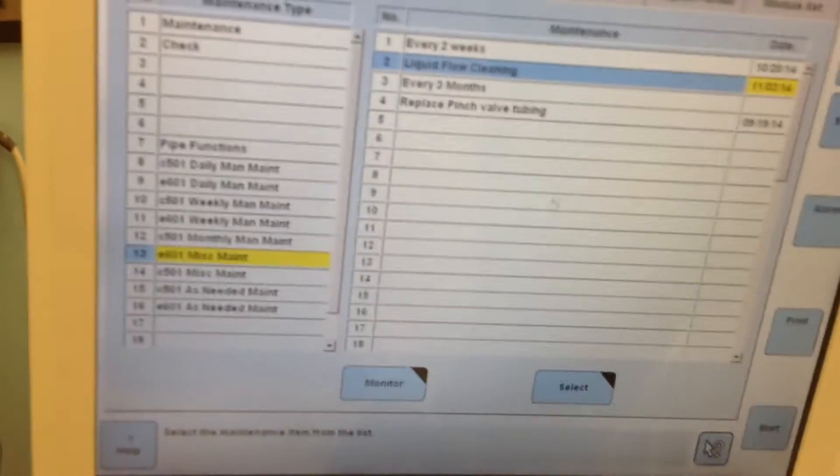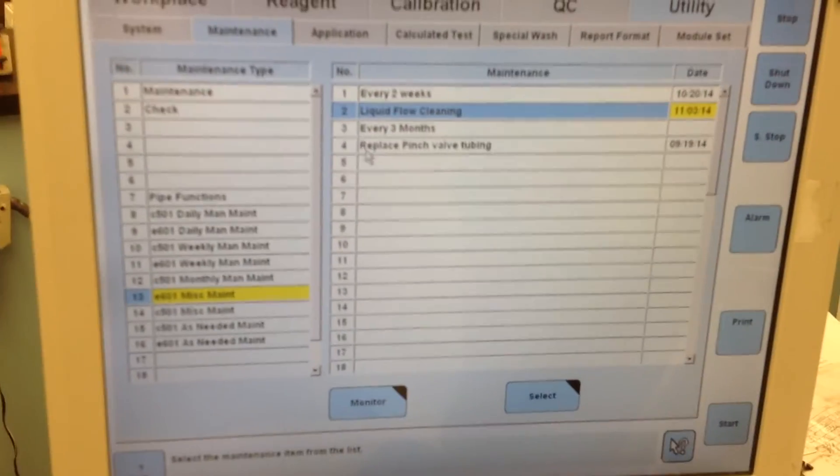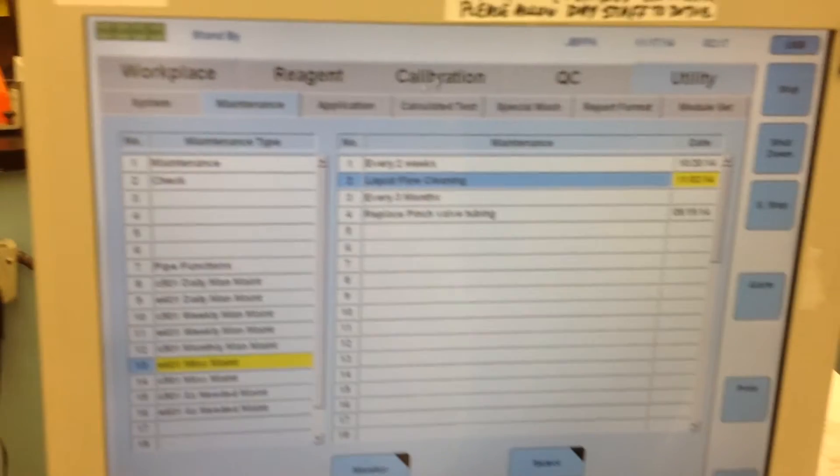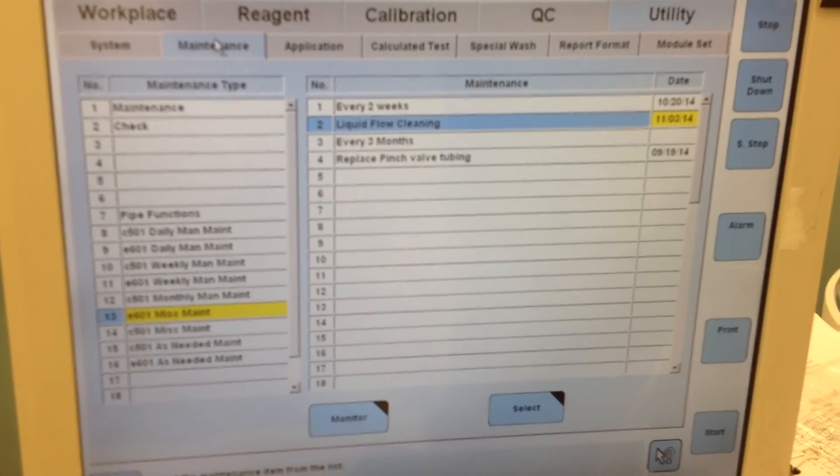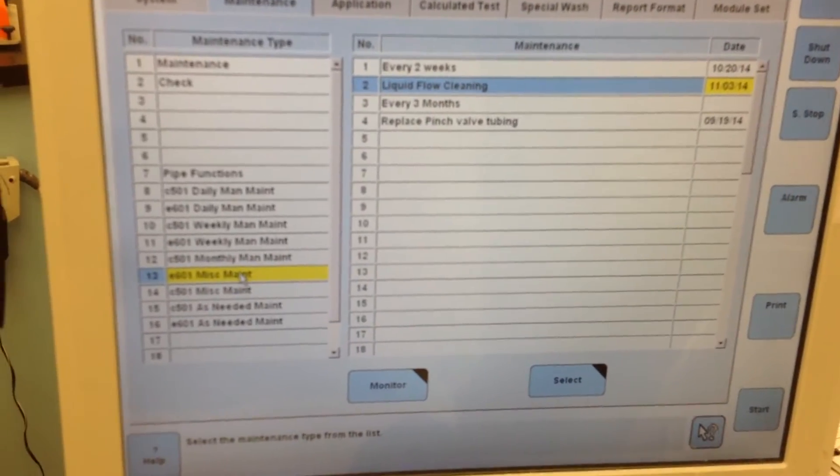As you can see, my computer wants me to run it. So then you would go to your Utility, Maintenance, and in Miscellaneous Maintenance.